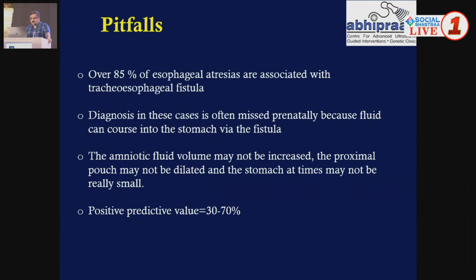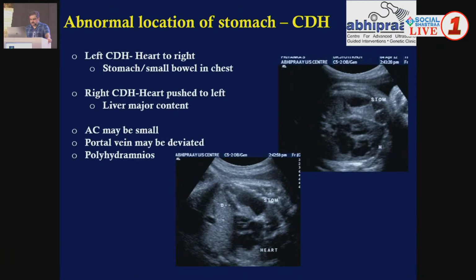You may or may not see it in the early gestation, but that's the reason why you may not see it early on, and as the strength of swallowing increases, the fetus can have that strength to dilate the collapsed upper esophageal pouch.